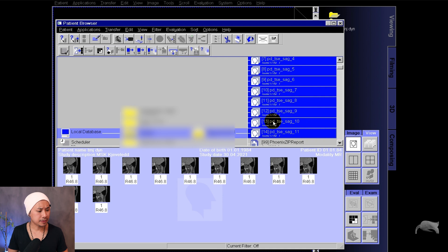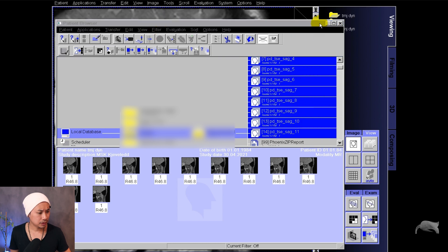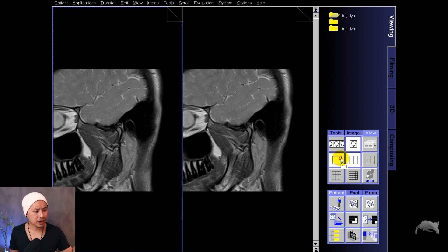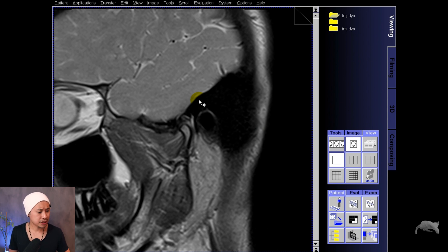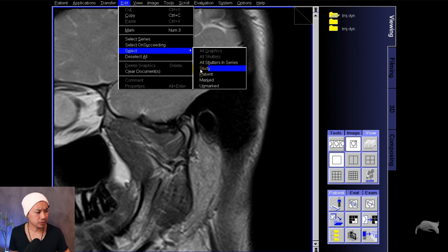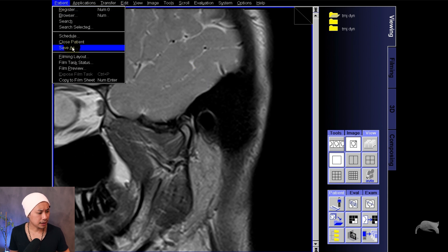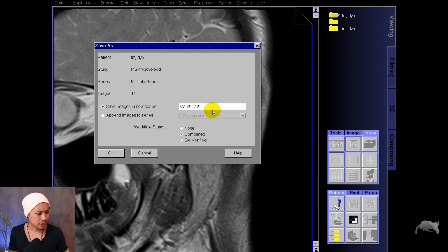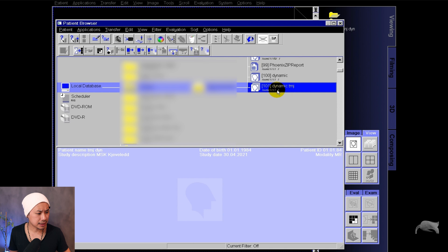Right now I'm just opening the browser and I'm going to mark all the sequences. In this test I did 11 scans, so I just mark them and drag and drop them into the viewing mode. You have different possibilities to view these images — four by one, two by one, and one by one. I recommend one by one, the big view, so it's much easier to do post-processing. Right-click, select series, edit, select, and then study. After you've done this, go to Save As. You can see you are saving 11 images — that's what I put in the view. You can rename this to whatever you want; I'm just going to call it Dynamic TMJ. Save that, close this, go back to the browser, and you can see the sequences right there.